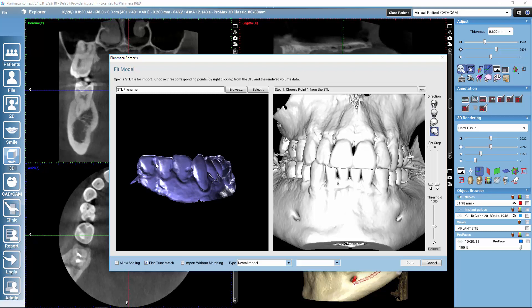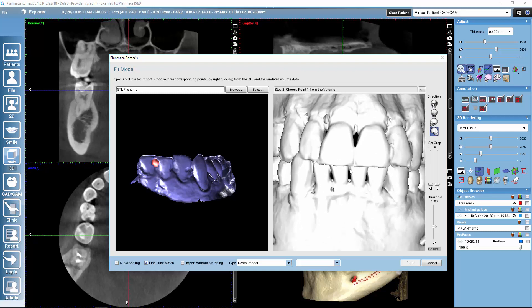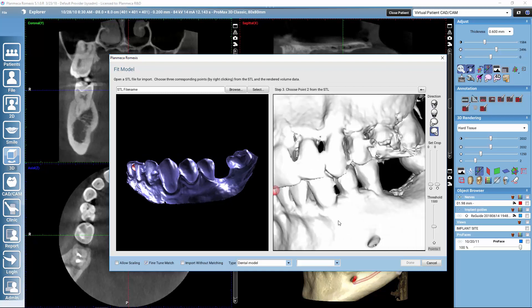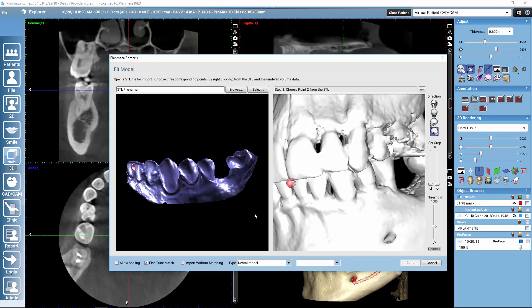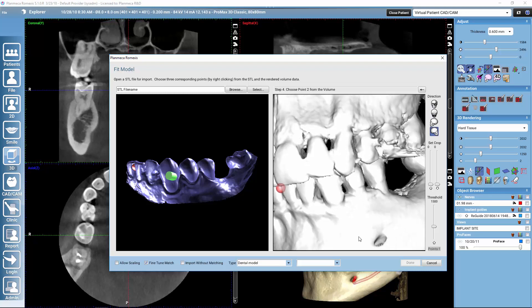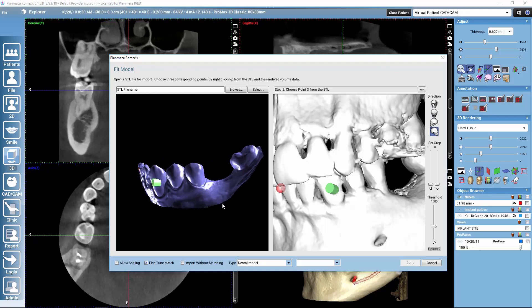We start always by selecting the first point from the left side image. We select the point with a right-click, and then we select the exact same point from the CBCT image. Then we can move the volumes and look where we want to place the second point. When selecting the points it is very important that we select the points far away from each other.